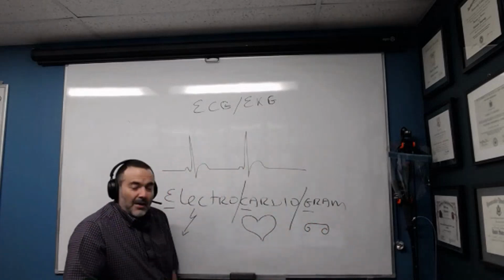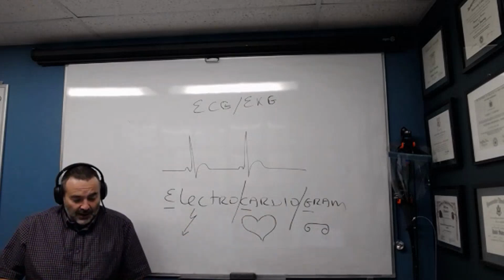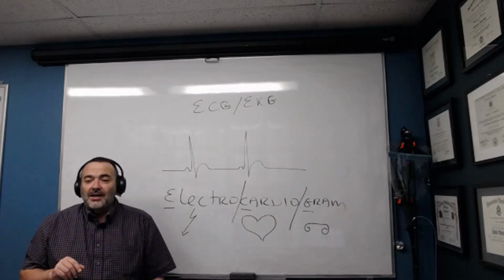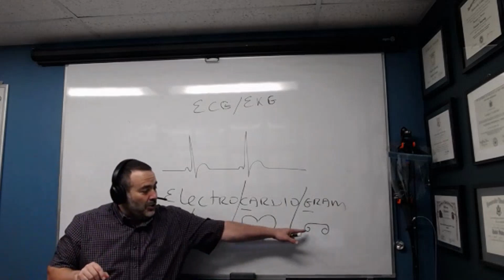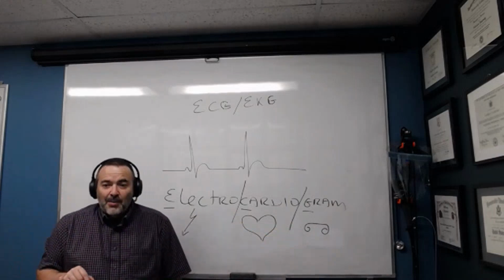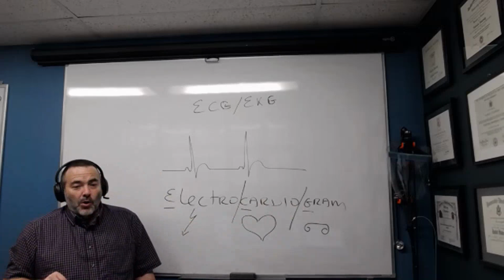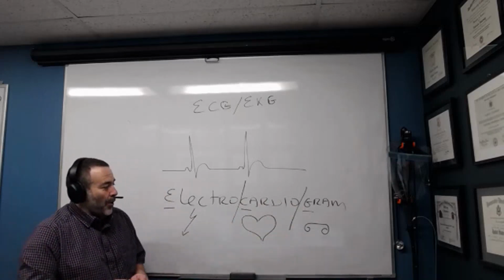And if you see this, if you don't know what this is, I'll point to your telephone. The number one key on your keypad has this little picture over here. This is a picture of what used to be called a reel-to-reel tape recorder that recorded things. And medical term gram actually means recording.